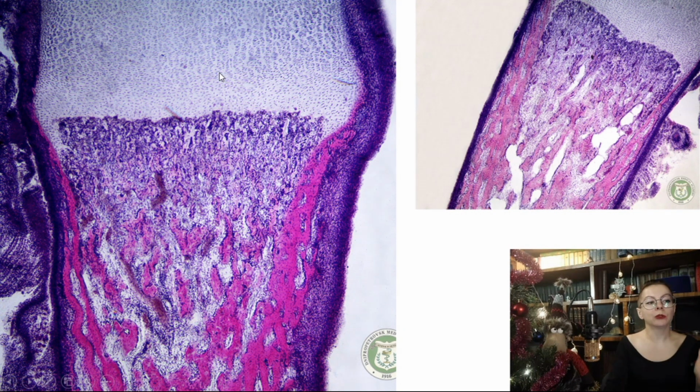Then this is endochondral ossification. The specimen is about the formation of bone tissue, and it is represented by a little bone made up of hyaline cartilage, and in the center, in the diaphysis, cartilage is already replaced with bone. So here we can see woven or primary bone tissue forming bone trabeculae, interconnected and oxyphilic in nature. So endochondral ossification, the specimen is represented by the small bone.